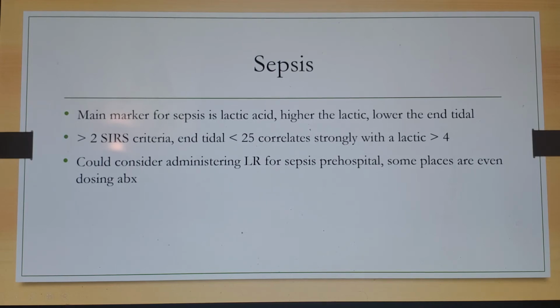And that helps you to prioritize your triage once you get to the hospital and things like that. And like I said, it helps guide your fluid resuscitation.